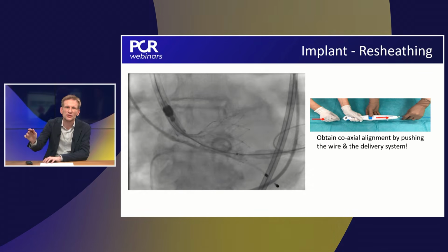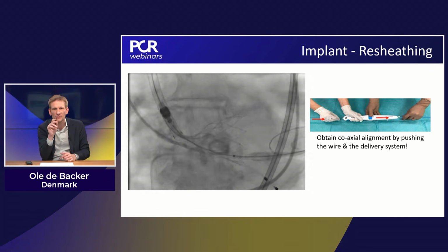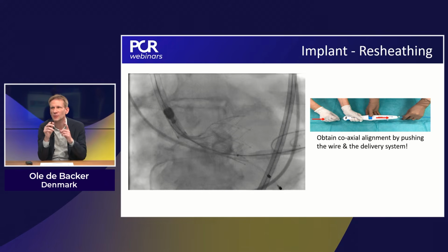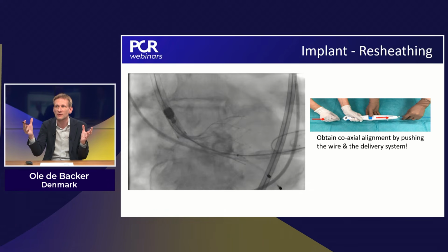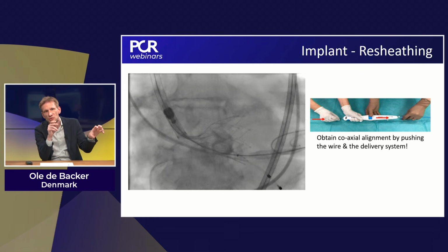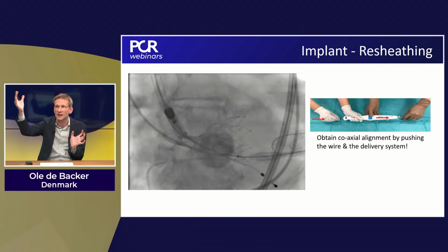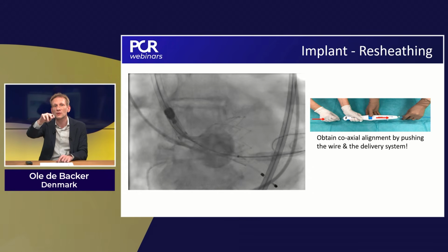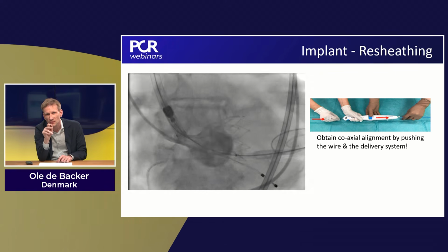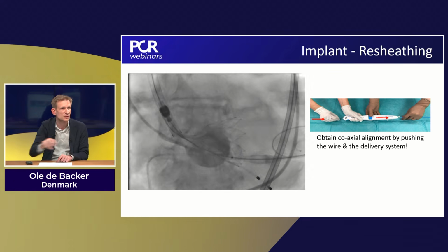But look, it's very important what you say there. You say it in a nonchalant way because it's so easy and logical for you. But there's one certitude in life: when you release tall frame valves, they will always follow the aorta. So here you see your valve sitting, the outflow part pushed to the outer curvature. When you release, what can you anticipate? That the valve will expand, especially to the left main side, the LCC side, and it will go down on the LCC. So you're sitting already at 10, 11 millimeters on the NCC, so you can be almost sure that on the left side it will follow the same and dive to 10, 11, and that's not what you want.